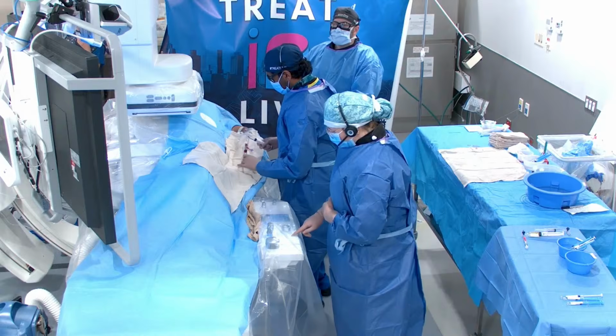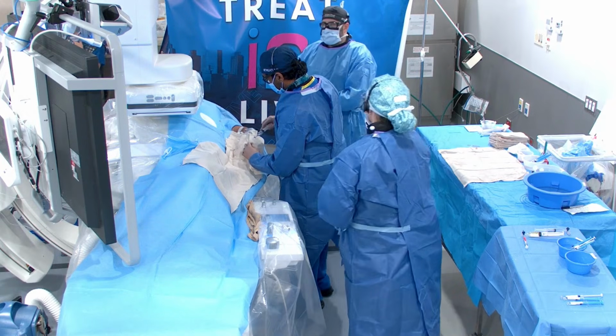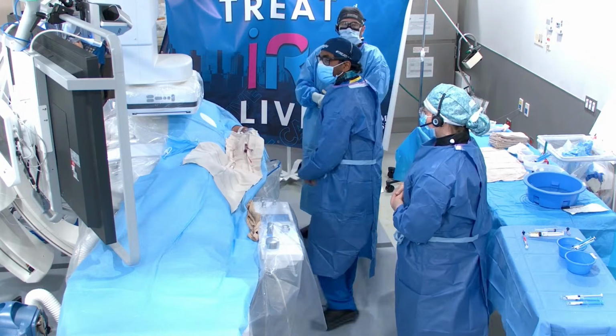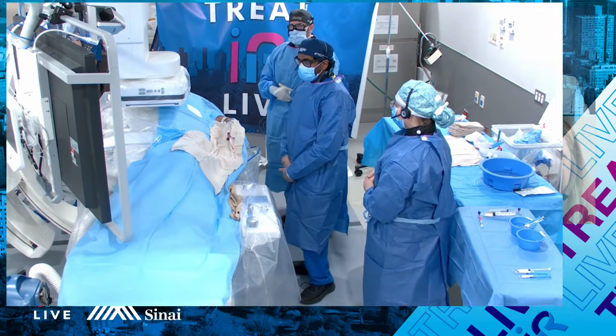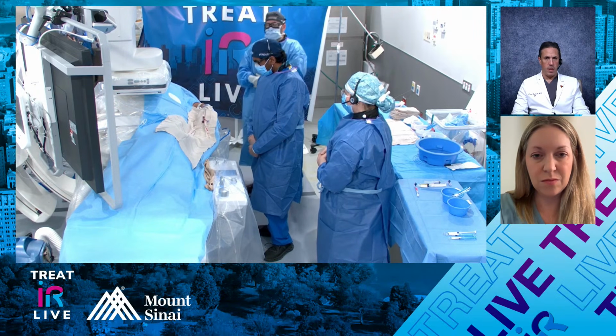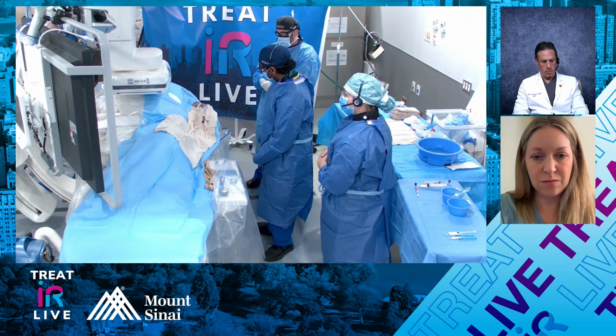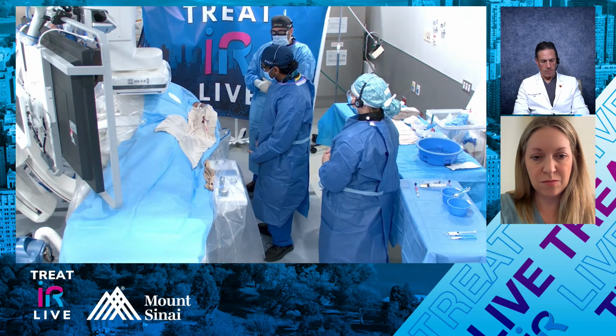Yeah, I can hear you guys great. Thanks for presenting this case, Jay. Before we talk a little bit about the clinical situation, I just want to hear from you both what the setup is, how you started the case, the access, and where you are right now, and then we can talk about the clinical aspects, which I have a lot of questions.